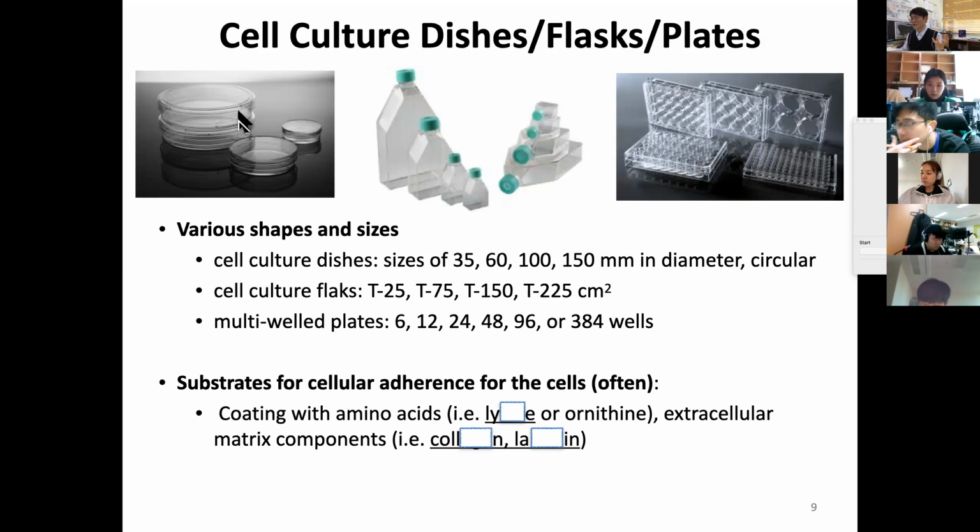The good thing is that it's cheap, easy, and convenient, but the downside is that when you open it, the top is completely open, so it's easy to contaminate. When you move your hands around on top by mistake, it's easier to contaminate. And when you shake it, the cell media are supposed to be in the bottom, but they can touch here, and that's where contamination easily occurs.